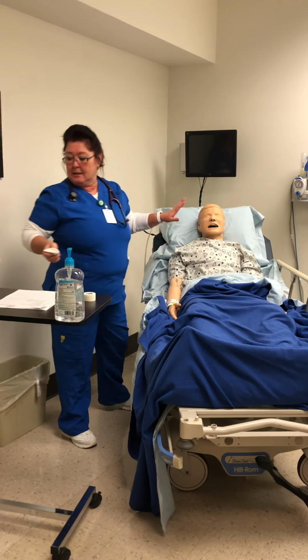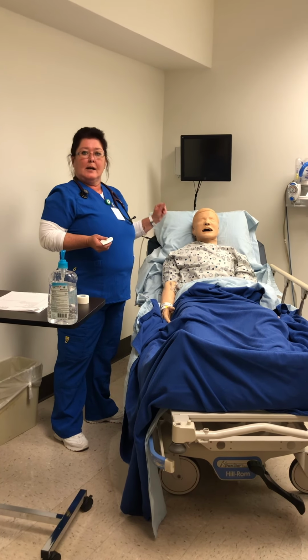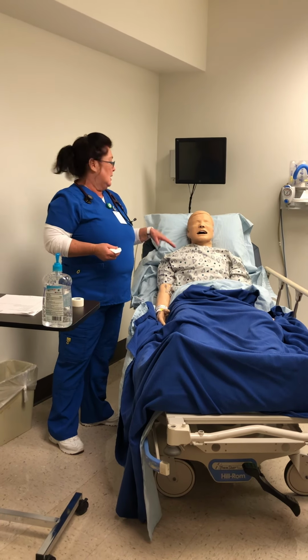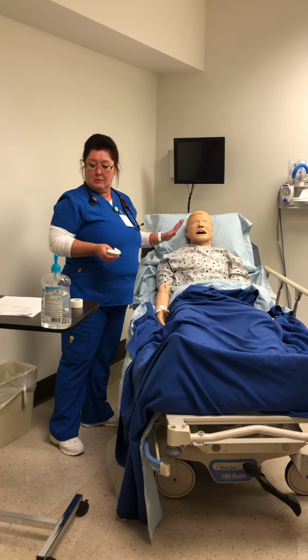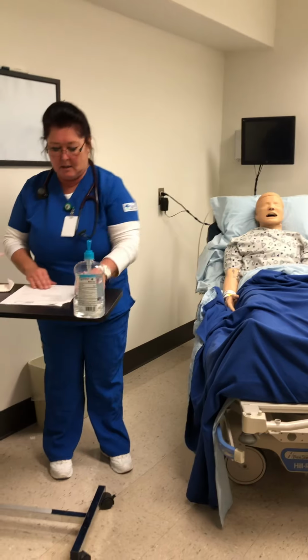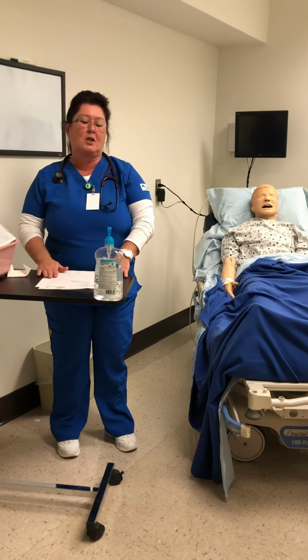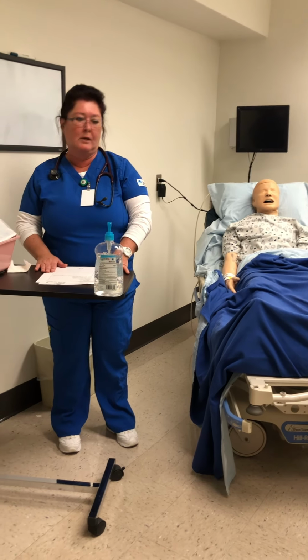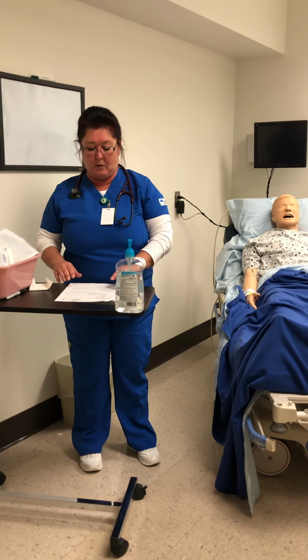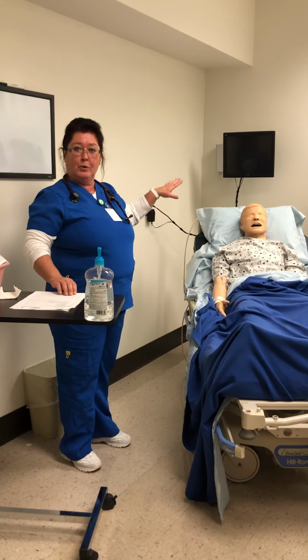If Shirley needs any type of assistance with oral care, I would do that for her also, as well as offering her some more water to get the taste out of her mouth. But she said that she's good and she's got it, so we will let her go. And I am now going to document what I have done. I'm documenting how the patient tolerated, the length of the tube. We're going to document the quadrant sounds, and I'm going to now measure the intake and output.